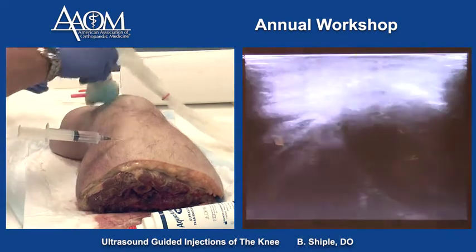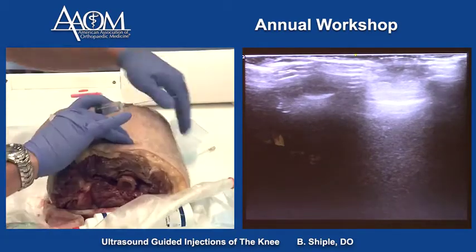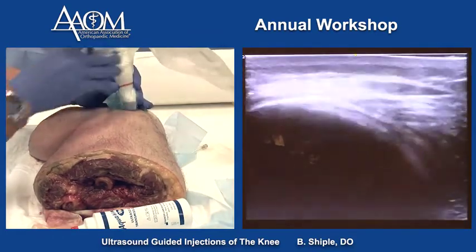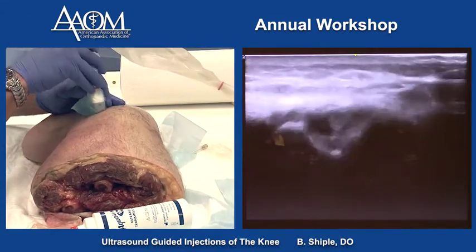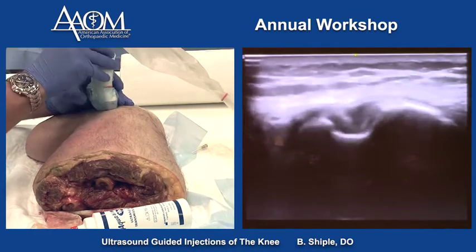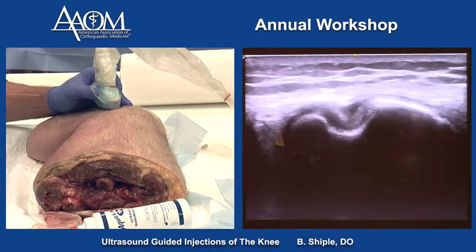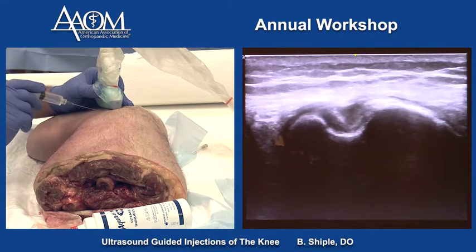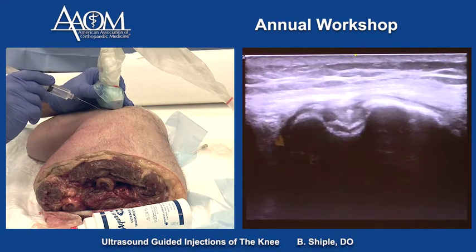The next technique on the lateral knee is a short axis technique to get the needle into the popliteus tendon. Make sure the probe is in proper position for a short axis technique. Put the tendon in the middle of the screen and enter about a centimeter away from the probe, going down into the tendon. That's a perfect position of the tendon.